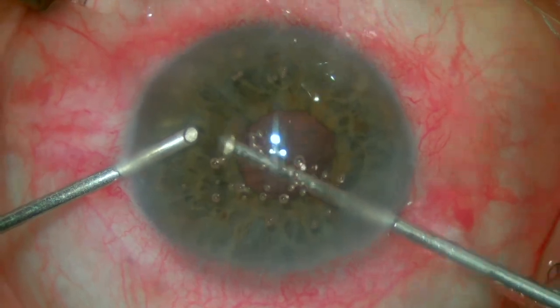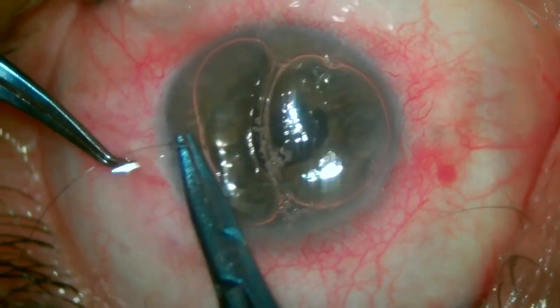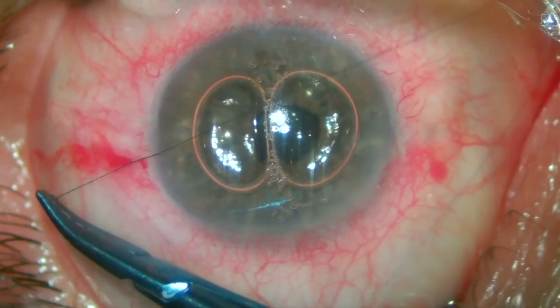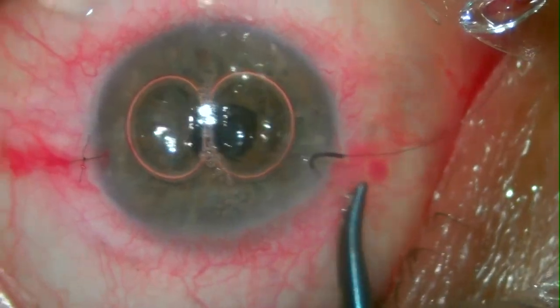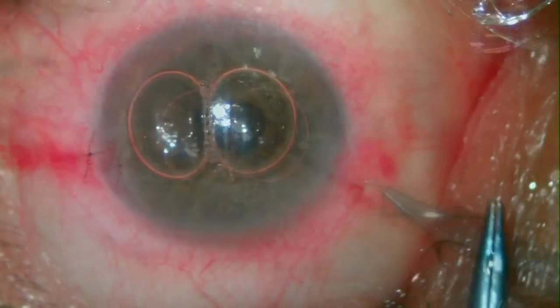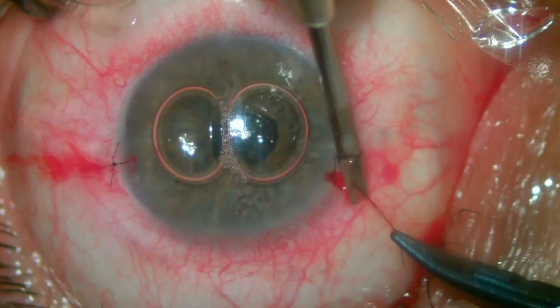Considering it's an eye that already had a complication, we are not taking any chances here, so we decide to put a nylon suture on each paracentesis. An air bubble may be useful in this step to prevent the AC from shallowing. Both sutures are adequately placed, trimmed short, and then rotated inside the sclera.